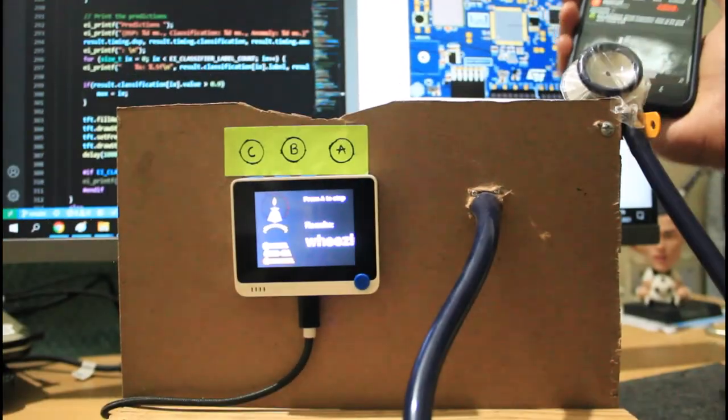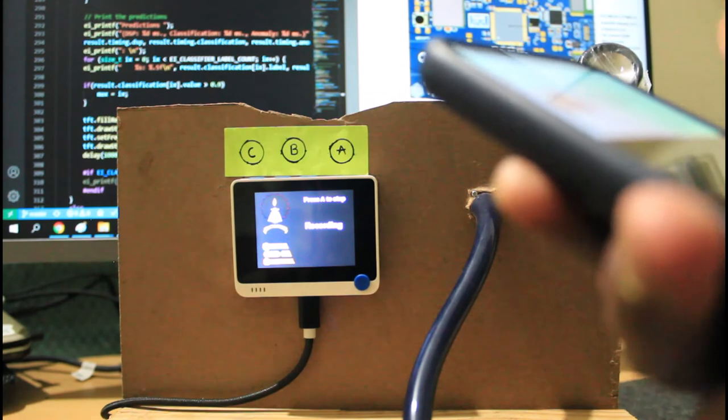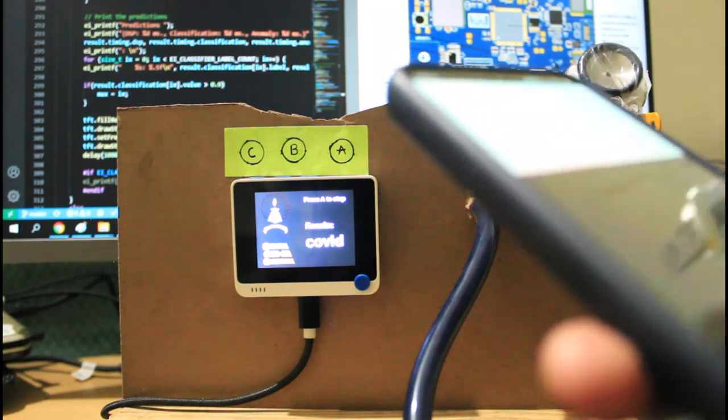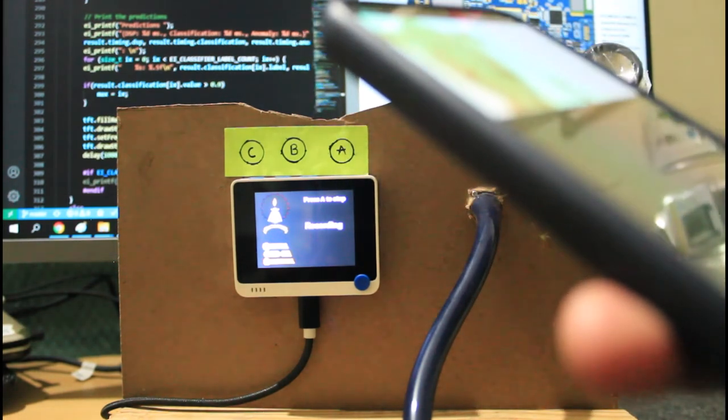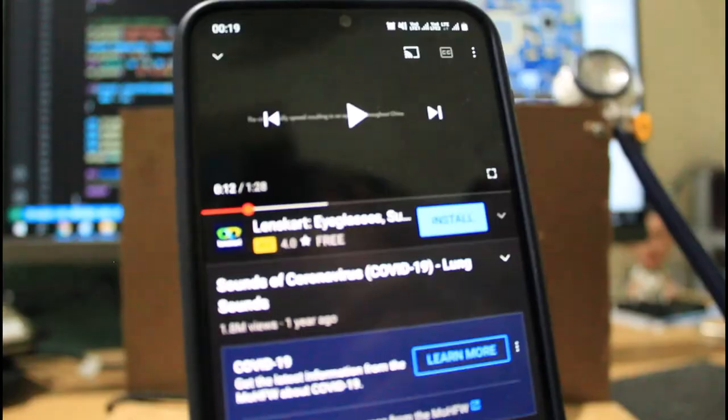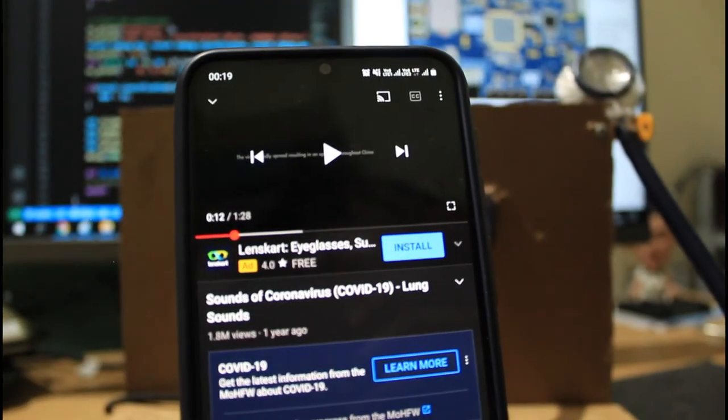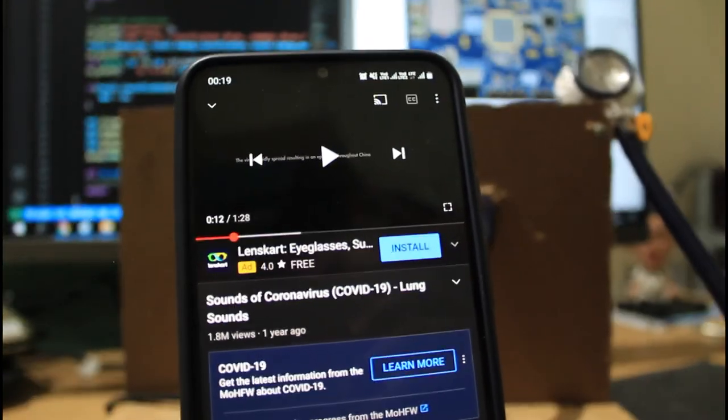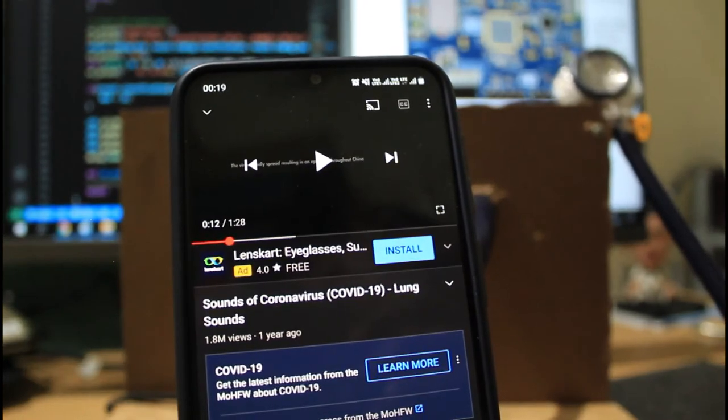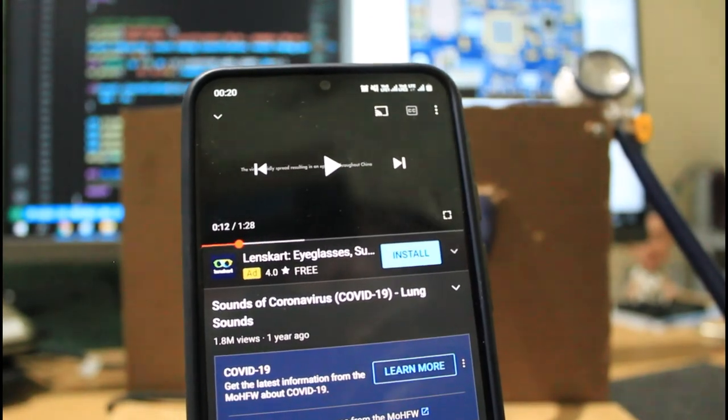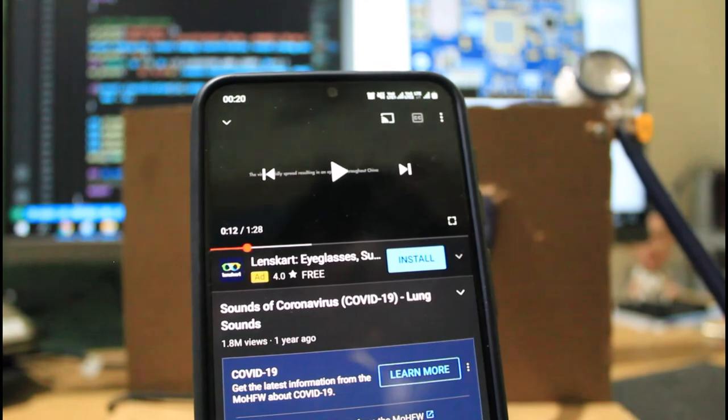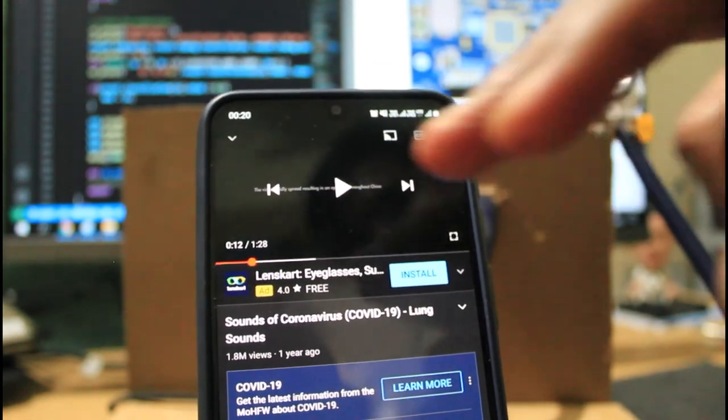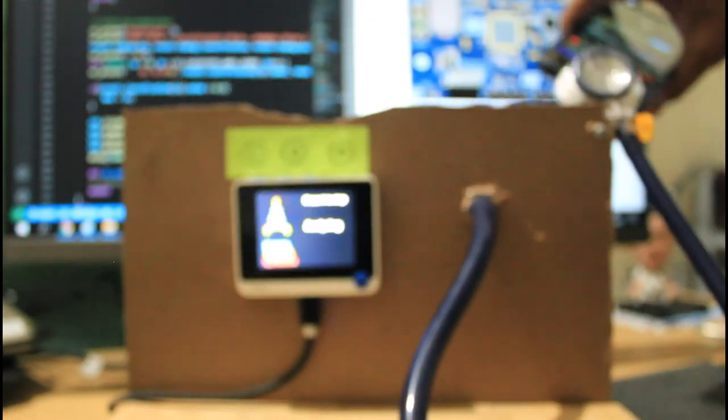Now, if I change it to COVID-19 patient, I am going to play the COVID-19 sound.